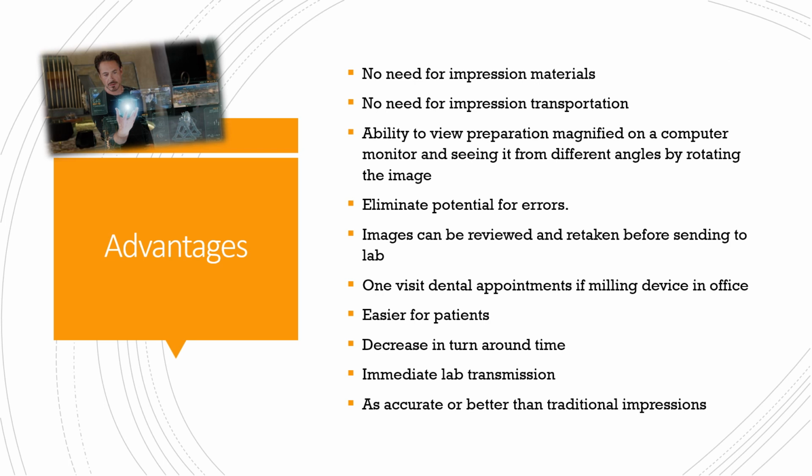Those can be stored and reused indefinitely, and they do not take any physical space in the office because it goes up into the cloud. So you don't have a paper chart or an actual model. Digital images can be used to point out problems to the patients. You can use them for educational purposes. There's no need for impression materials, be it trays, alginate, plaster, trimmers.